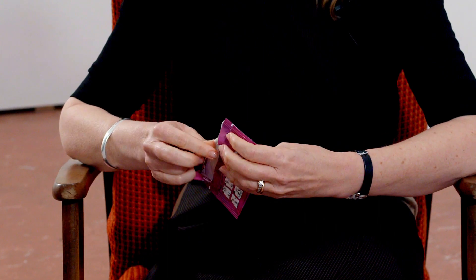Another alternative to the male condom is the female condom. To use a female condom, it's important to check the expiry date, because it is a single-use condom. Then tear the condom packaging open.